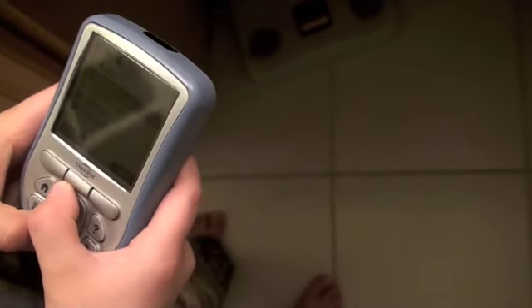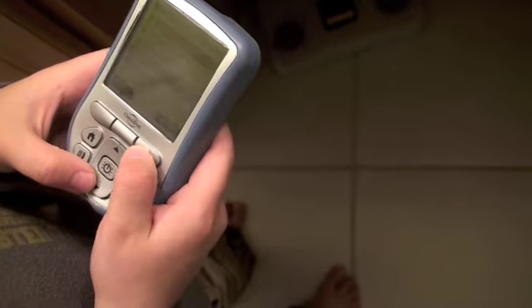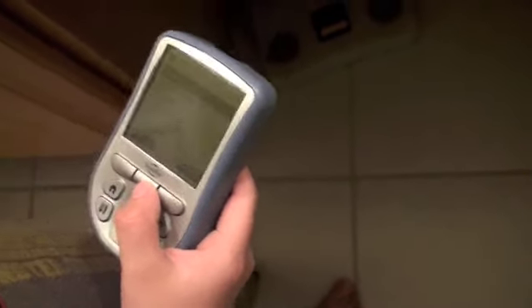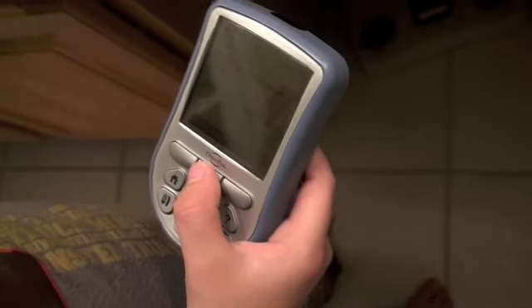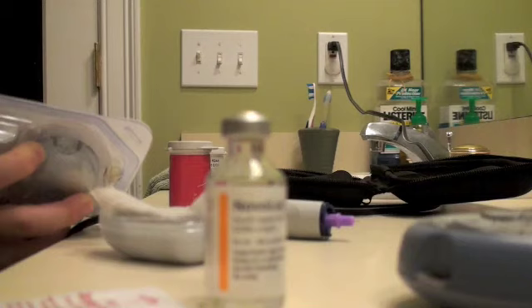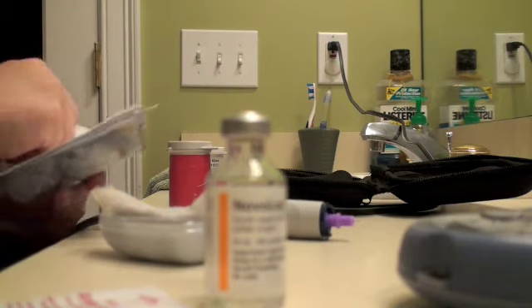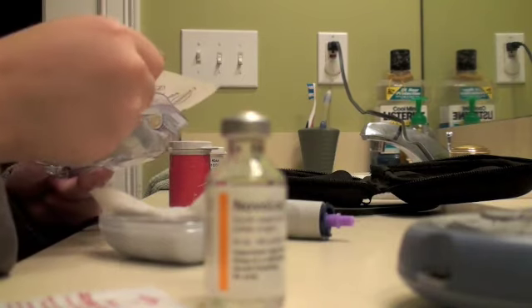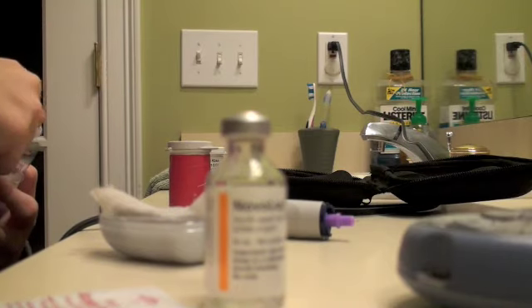Settings. Select. What does it say? Change pod. It sounds like daddy. Here, let's put triple antibiotic on your old insertion.